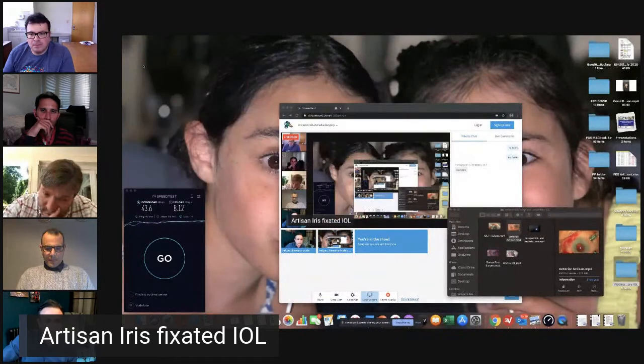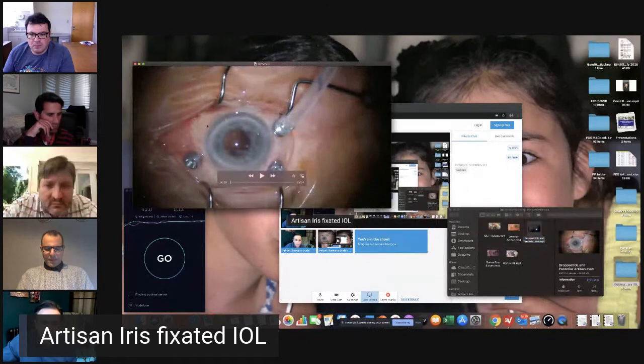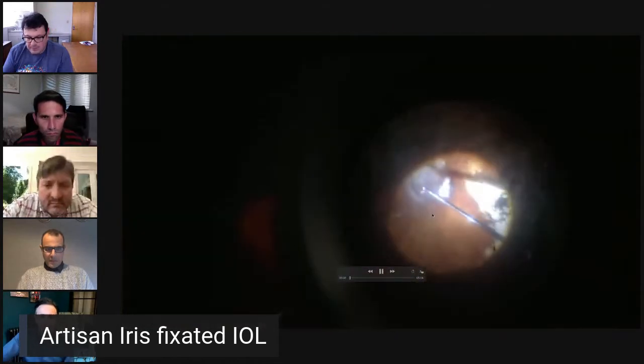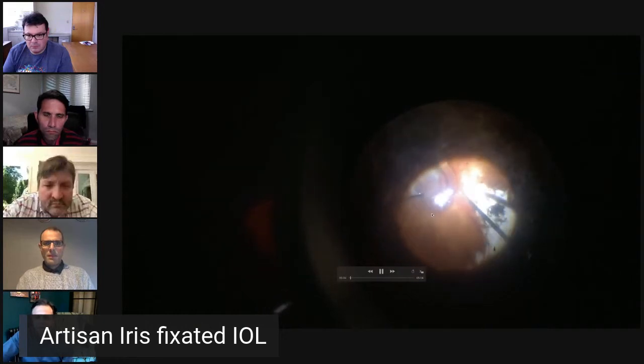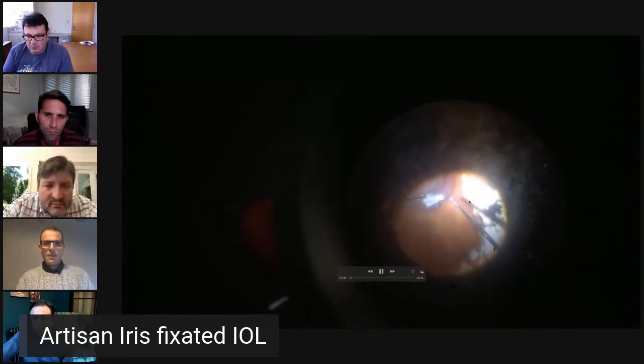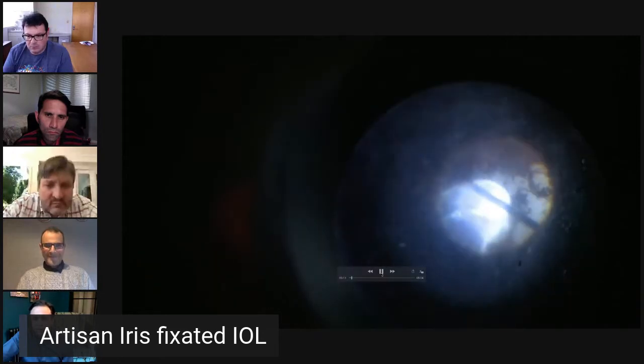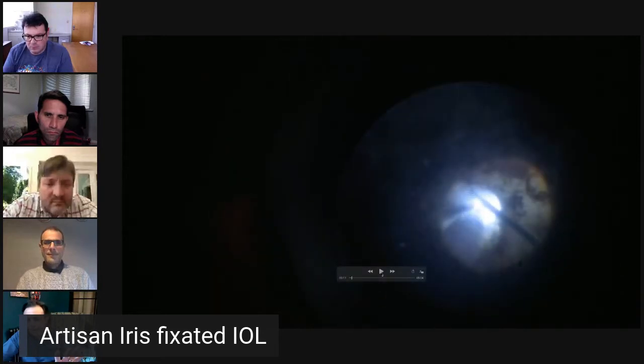Next is a posterior artisan lens. This is a combined video which is showing basically the retrieval of a dislocated intraocular lens within a bag. As you can see, I'm using a 27 gauge here. I'm trying to aspirate. The nice thing with 27 gauge is that you can get very close to the retina, and that's why you're less likely to end up hitting the retina. And obviously that comes with experience.